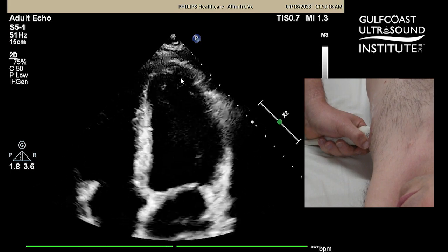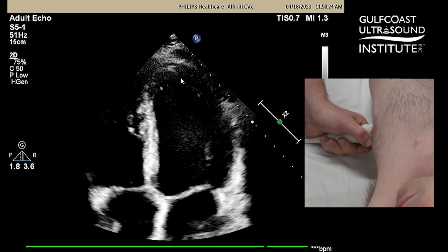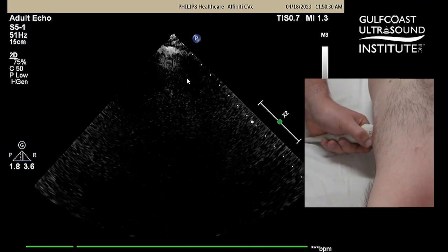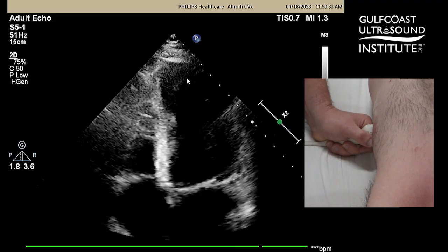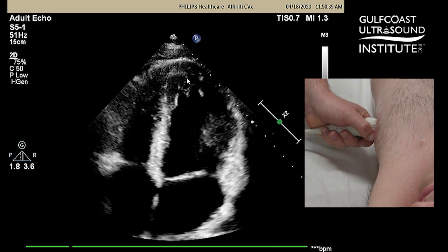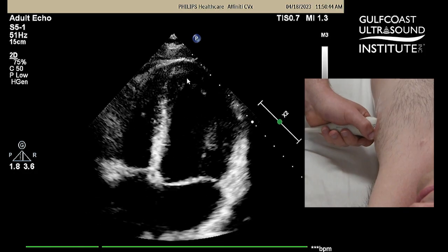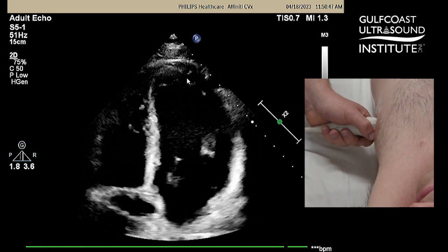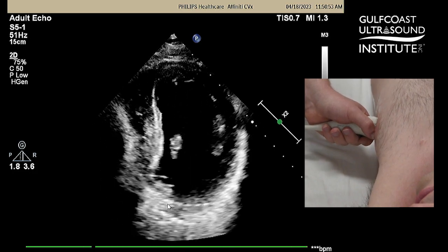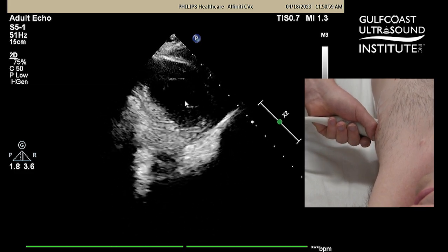Whenever there is an apical abnormality — if the apex is out — mainly looking for a thrombus or trabeculations, it's very helpful to visualize the entire apex. From your on-axis apical view, go a little medial, then tilt your transducer posteriorly to follow the apex. As I come up posterior, I know I'm going posterior because I see the coronary sinus start to come in.